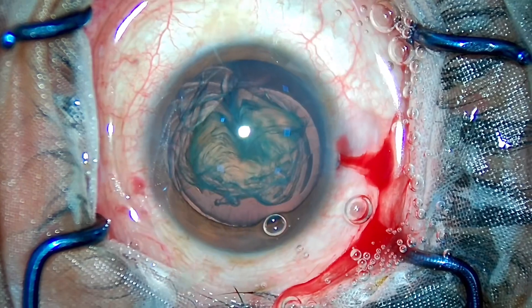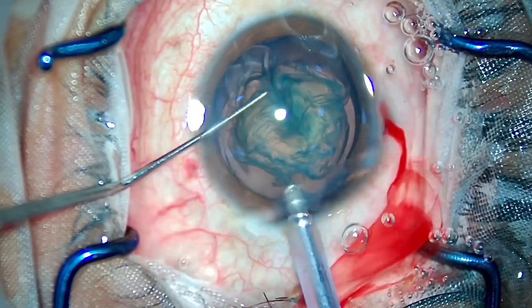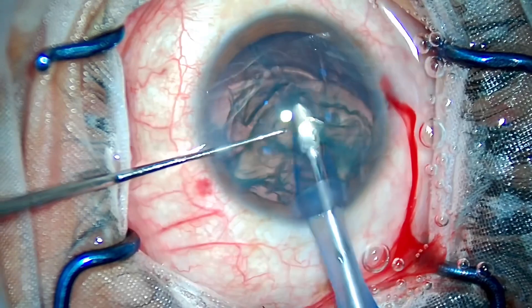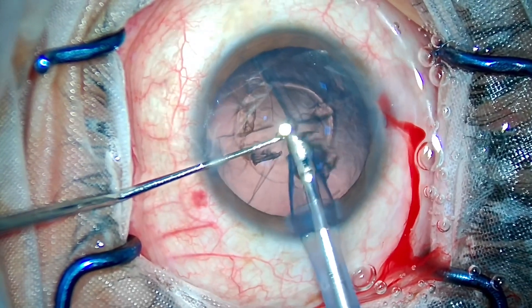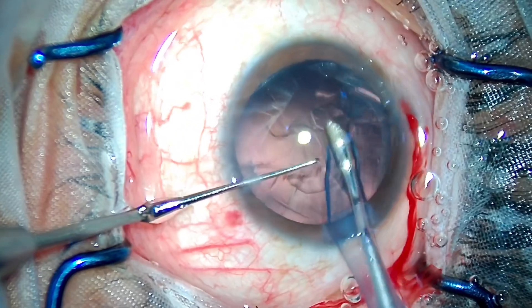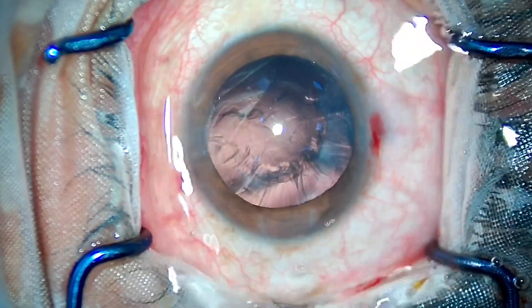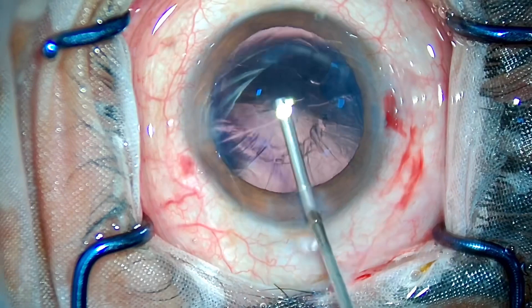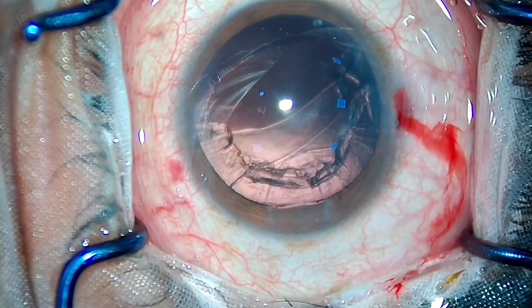Coming to the phaco part, which is relatively very easy in these cases — you don't need to use any ultrasound energy; you just have to aspirate the nucleus and cortex using minimal vacuum. I would recommend beginners not to attempt aspirating the cortex by phaco, as it needs a little experience and confidence with the phaco pedal. Beginners should stick with the standard steps of aspirating the cortex only with irrigation and aspiration.